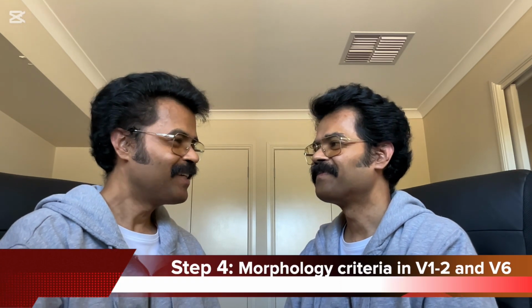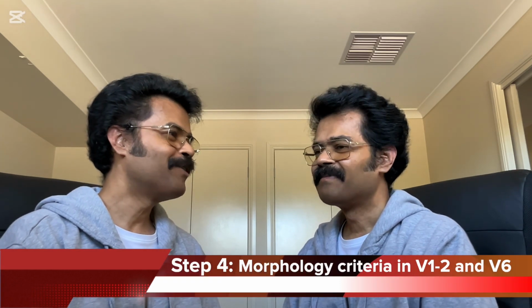That's brilliant. Thank you for the explanation of the step 3, which is the atrioventricular dissociation. So if somebody has got atrioventricular dissociation with a wide QRS complex tachycardia, there is a 98% chance that this is VT. If the atrioventricular dissociation is absent, we are going for step 4. So please tell us a little bit more about step 4.